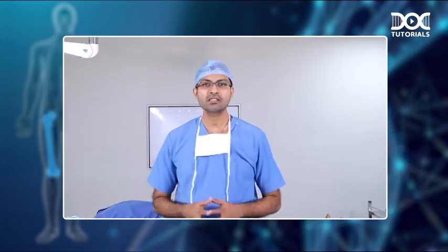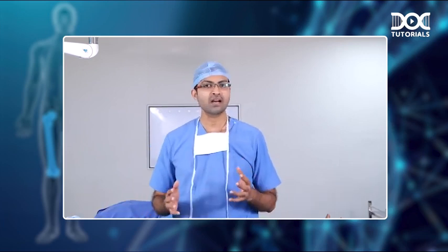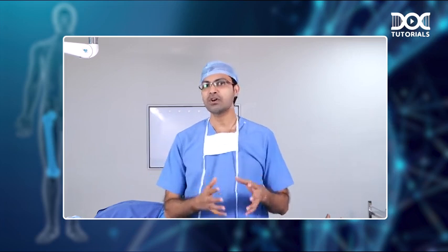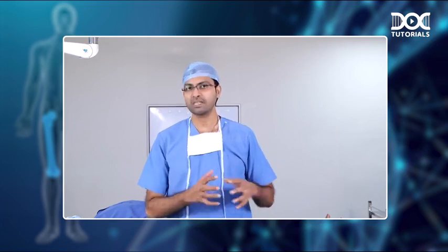Now let's discuss how can we apply plaster of Paris in a patient with an injury to a limb. So plaster of Paris slabs and casts are the primary modality of treatment in most of the injuries in orthopedics. And as far as an UG or a house surgeon is concerned, the primary role for you is to learn how to put a slab.